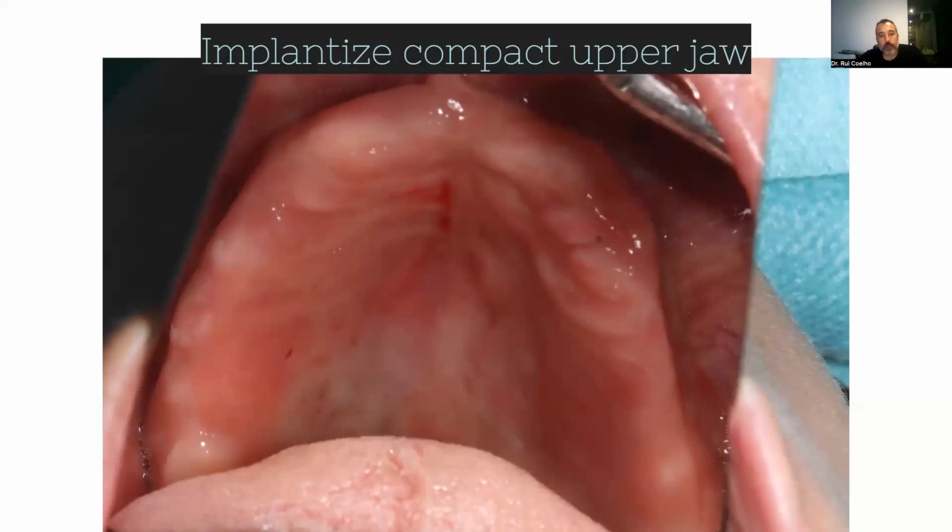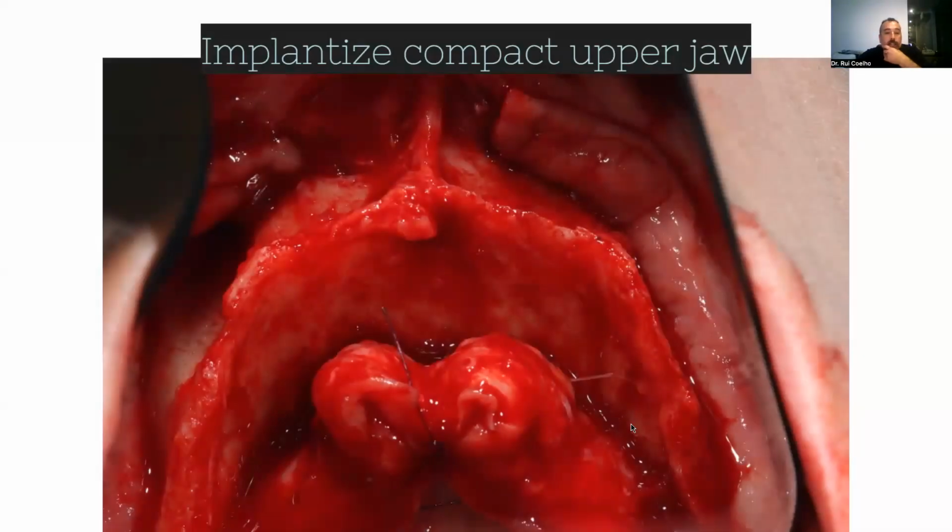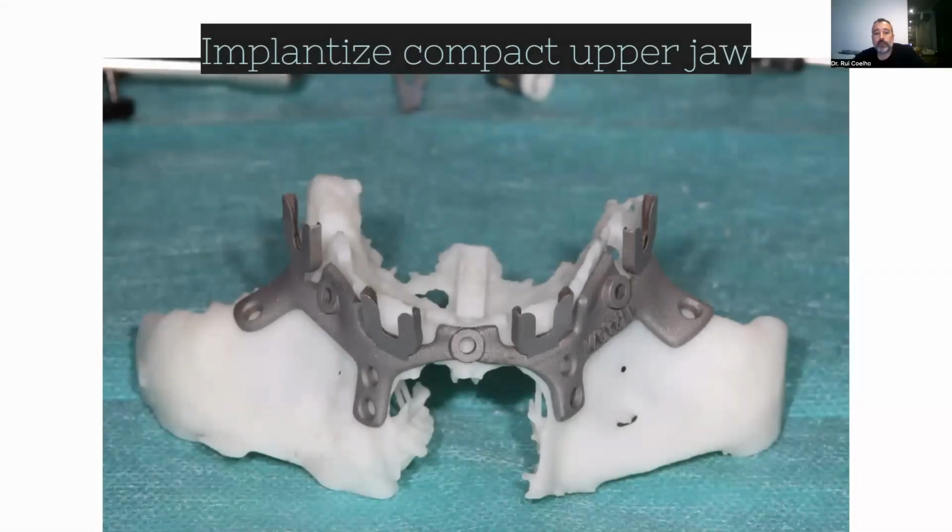What we do is a horseshoe opening, just placing it like this, making this flap, so that we can see all this part. It's not much different from zygoma or even from the superior approach. So in reality, it's the same approach. But what we have is this type of guide, okay? This guide is important. These slots will guide the drills that make the preparation of the bone. So you need these slots to make this preparation for the implant be in the same place that we have projected, okay?